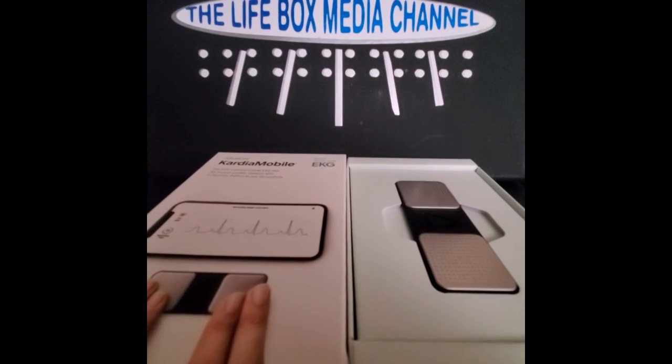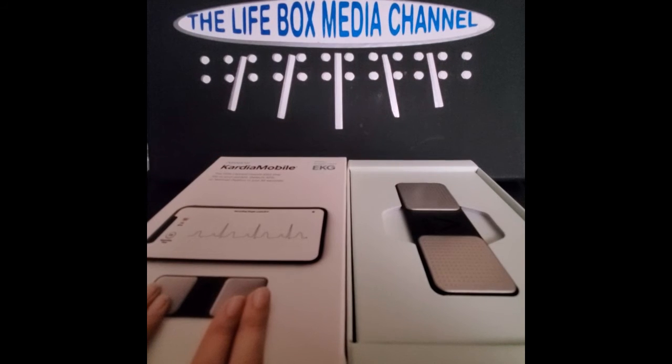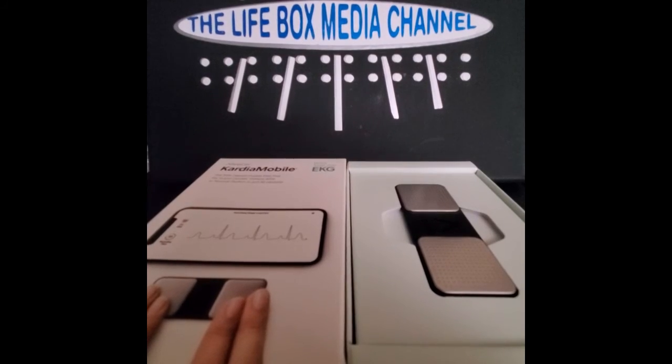Don't let any sounds go off — turn off the TV, and don't have anyone talking when you're doing it. It takes 30 seconds, you have to hold still, and you download the app to use it. It's really pretty cool — Life Box Media Channel says it's a pretty good deal.